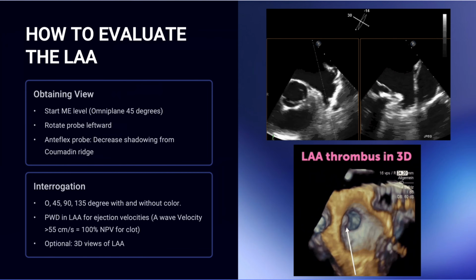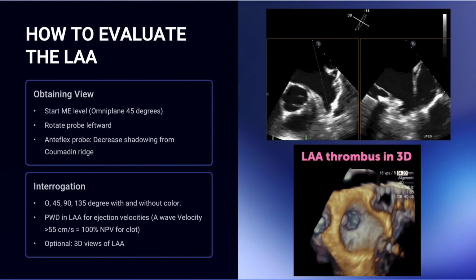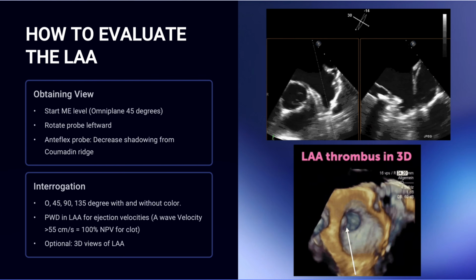Finally, if there's something I want to confirm in my 2D views, I'll perform a 3D assessment to see if I can get one more view to understand the whole picture of what's happening in the appendage.